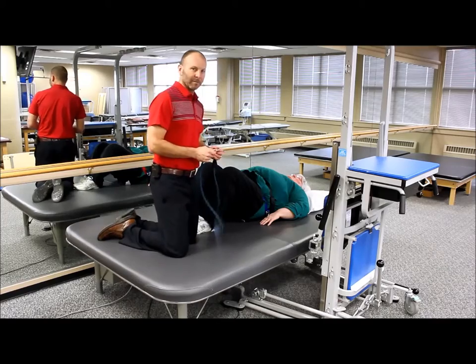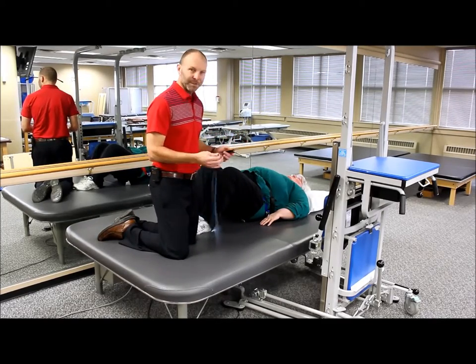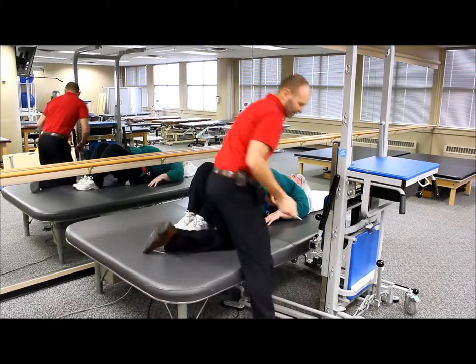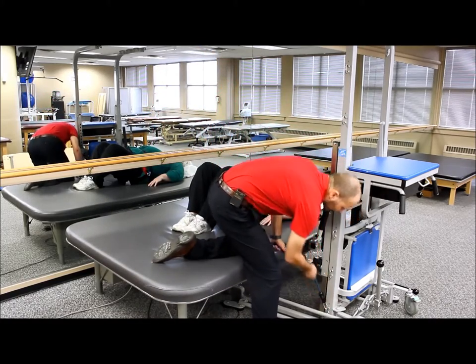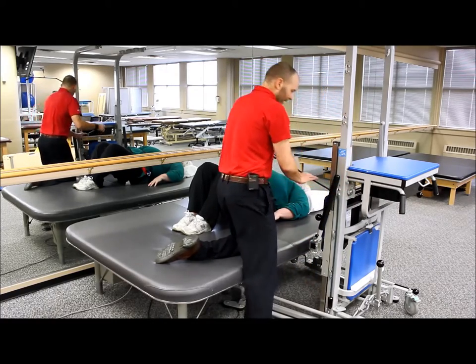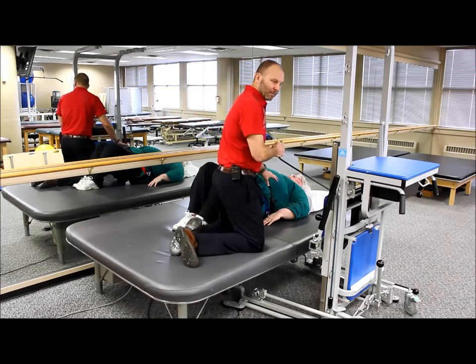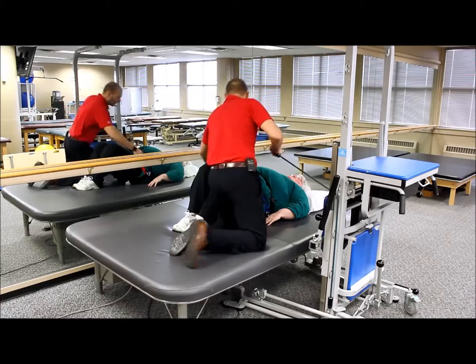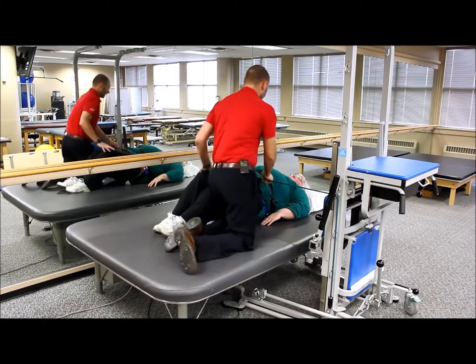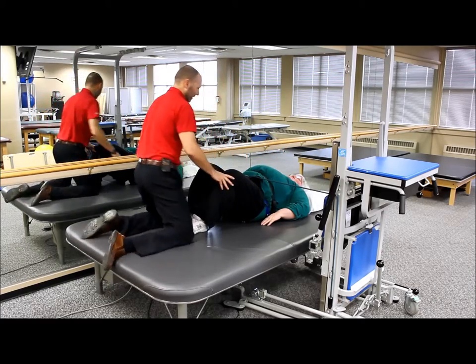Another functional activity we can use the rehab station for is some basic rolling maneuvers or assisted rolling. We're going to use our bungee cord here, clip this onto the number six, come through the number three, then bring that across the patient's body. We've got our lower body piece support on here and we're going to attach that across the body. That's going to provide assistance for rolling towards her left side.